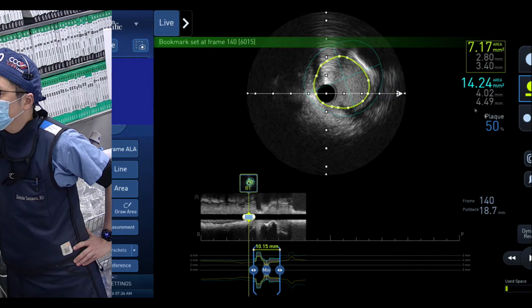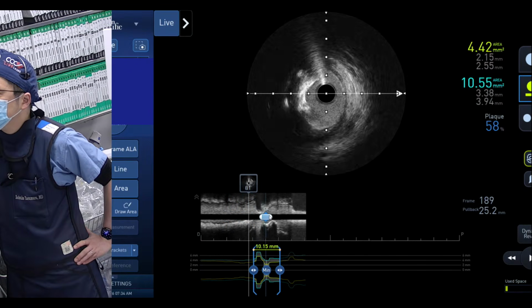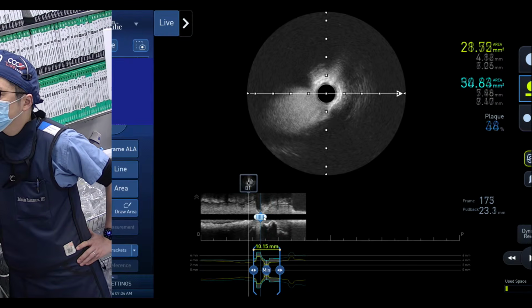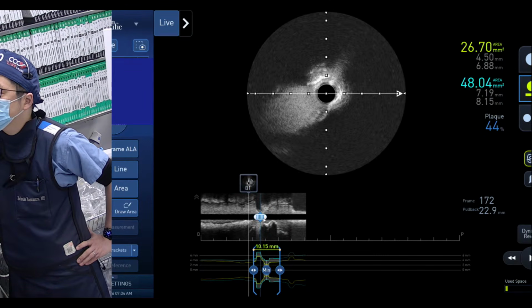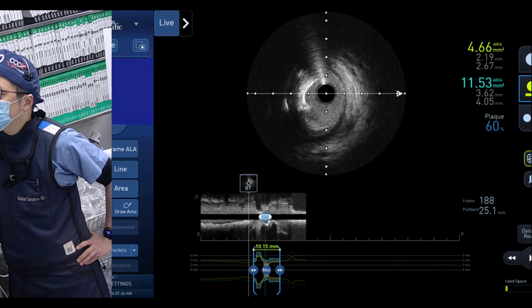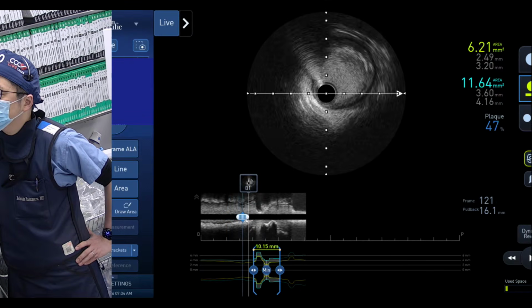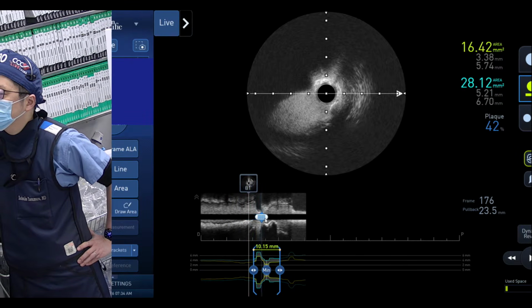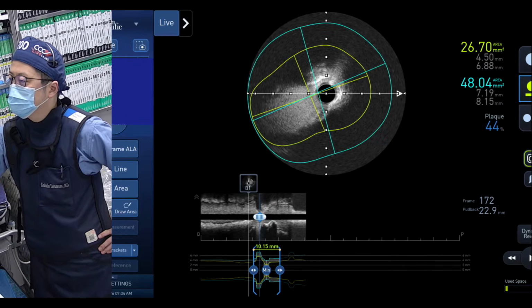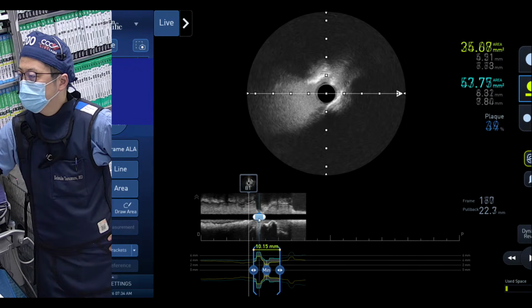Actually, you know what? This makes the case very simple now. Stent across? Clearly that ostial, so you remember that even happened in the FAME 1 trial, where they recalibrated 2-vessel and 3-vessel disease, and many of the 3-vessel became 1-vessel, and about 6% became 0-vessel based on the FFR. But this is imaging, while that was based on FFR. So one is anatomical CAD, second is physiological CAD, and third you can say imaging CAD. Here the circ looks very good. I don't think we need to do anything here.